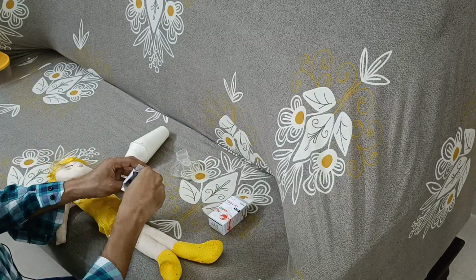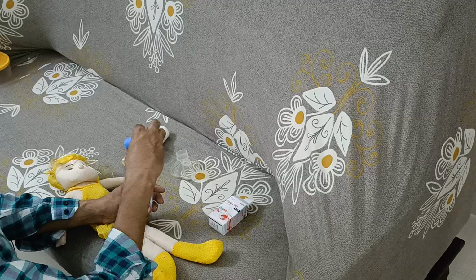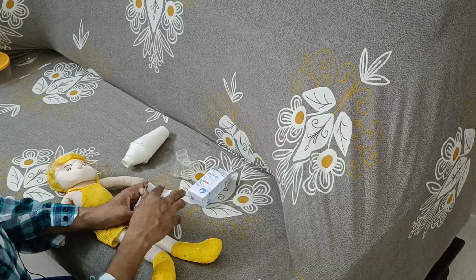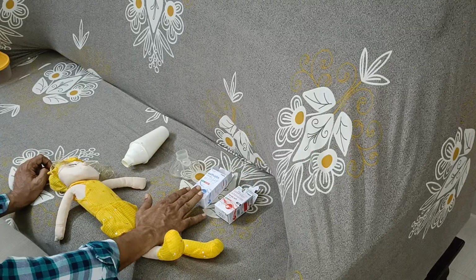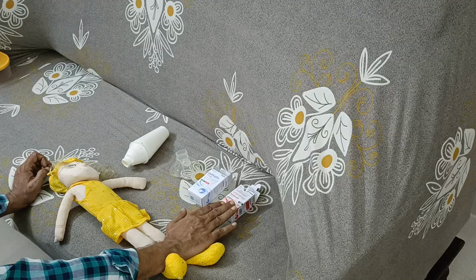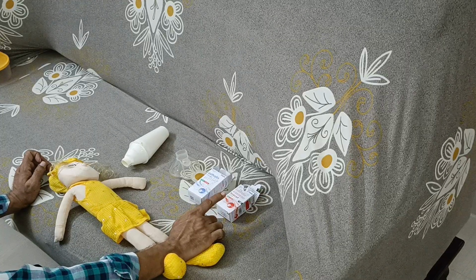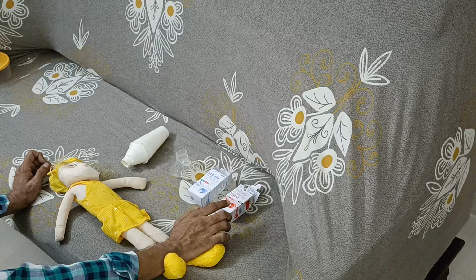Okay, I have a model inhalation here. So this is the inhalation called a blue inhalation. Blue inhalation is basically a bronchodilator, and the other one is a brown inhalation, which is going to be a steroid. Okay, so in both scenarios, in the case of the bronchodilator you have to talk to the patient. There is no specific instruction, but in the case of the steroid, you have to go for health education in which you have to go for a mouthwash straight after the procedure. Straight after the procedure, you have to go for a mouthwash because there is a high chance of the child getting thrush in the mouth. So the examiner is going to look for that. So that's your job. Okay.